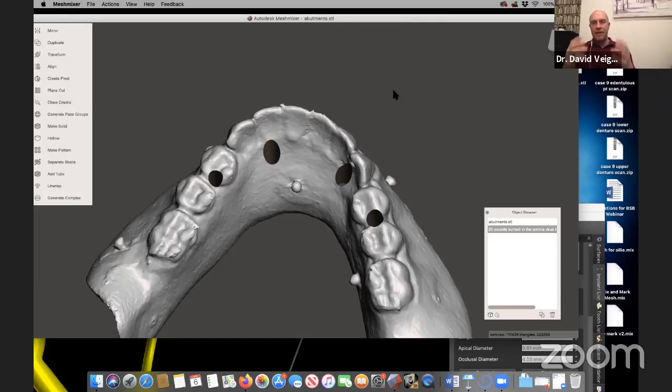I take everything off and I go downstairs and I pour my master model from that. And what that'll do is it will give me an implant position, which has essentially a Duralay jig on it, but it is a Duralay jig that's been on the patient during the entire integration phase, which means that there can be essentially no more passive restoration than that one.